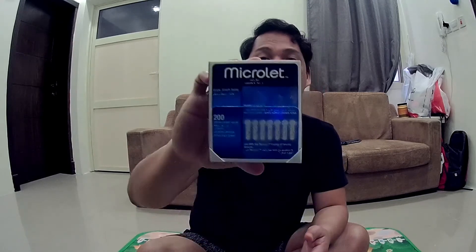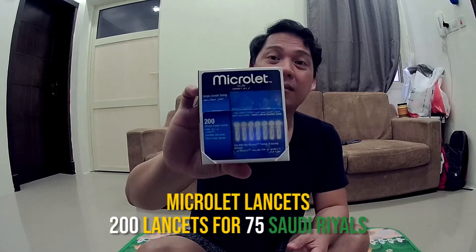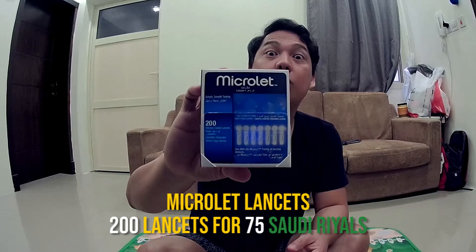The last meal I had was last night at 9 p.m., and now it's 9 a.m., so I basically have 12 hours of fasting. I also bought a generic lancet — I got it for 75 riyals and it has 200 lancets.